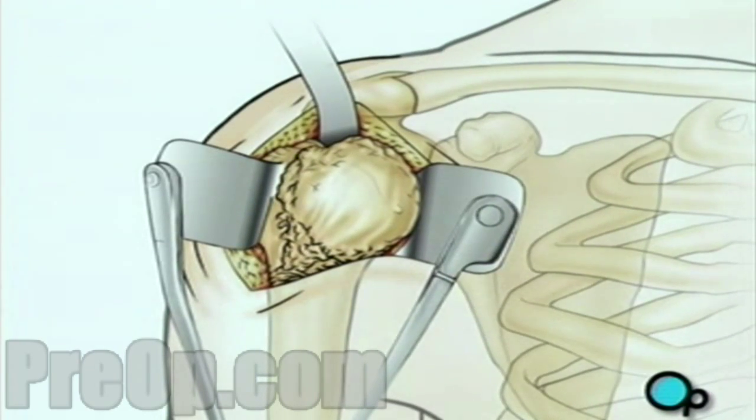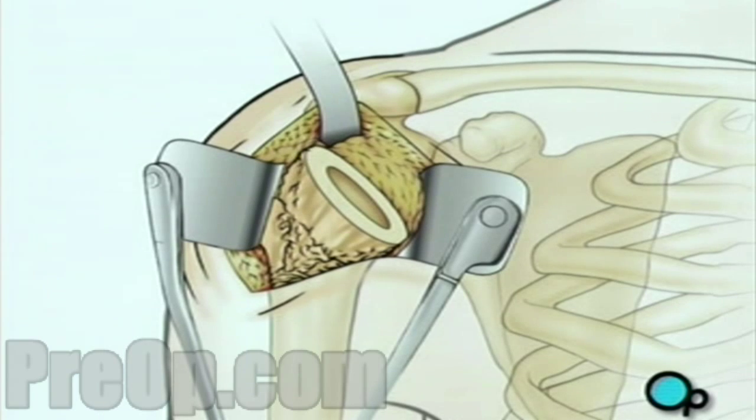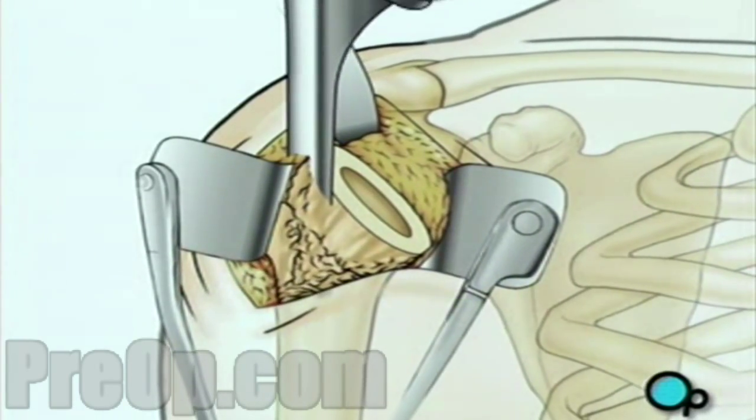Using a precision surgical saw, your doctor will carefully remove the ball-shaped end of the upper arm. Then the surgical team will use a high-speed drill to hollow out the top of the arm bone. A specially fitted artificial ball joint slides into the top of the arm bone.